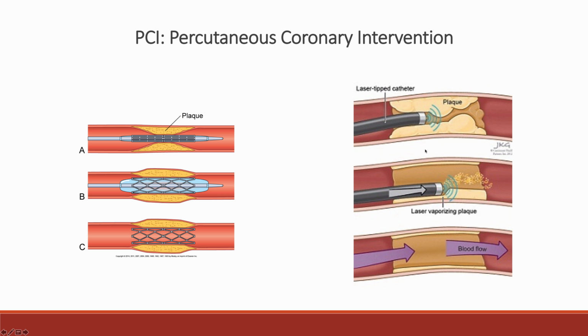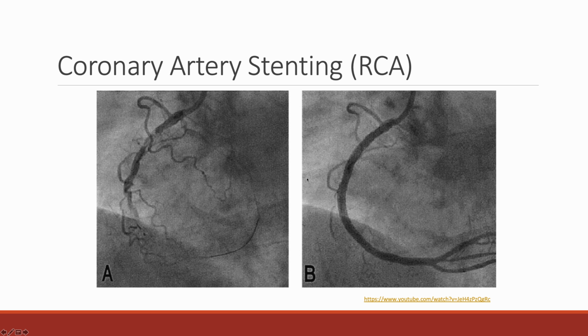And it probably has to do with the fact that when you get rid of this plaque, it's not cholesterol that you're cutting through first. The first thing that you're cutting through is the endothelial layer, right? And so then you leave this bare plaque open in the vessel, and that is atherogenic and thrombogenic as well. So, you know, the days of the laser atherectomy, I think, are largely past now, but they can be useful in certain circumstances.